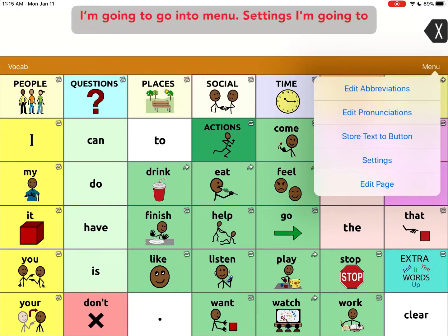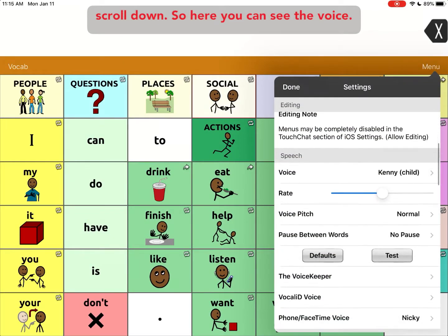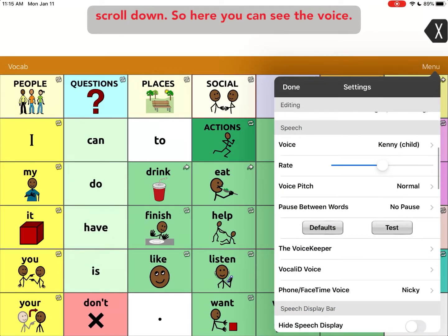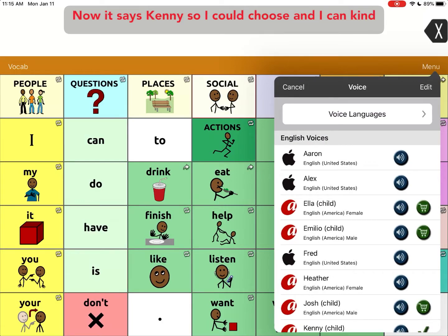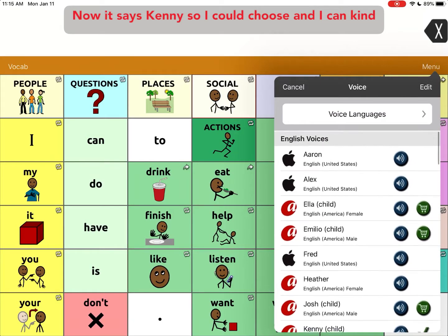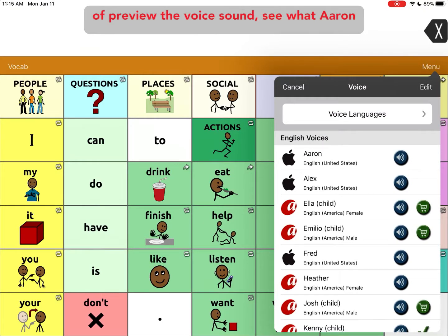I'm going to go into menu settings and scroll down. Here you can see the voice — right now it says Kenny.